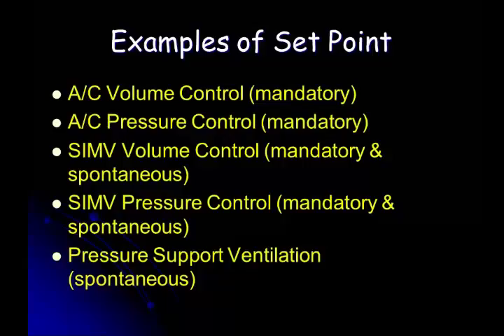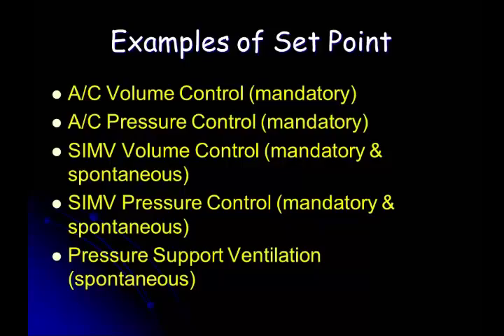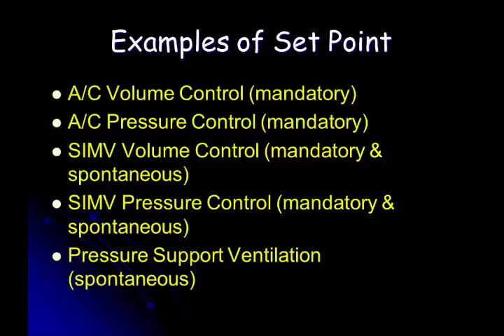So they can breathe spontaneously during that time. They start the breath, they end the breath. Basically, the system opens a separate valve and lets them breathe spontaneously. When it's time for the next breath, it delivers the next breath in a synchronized fashion, whether or not they spontaneously breathe.